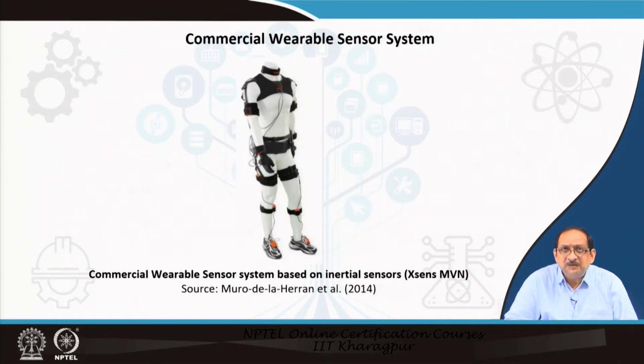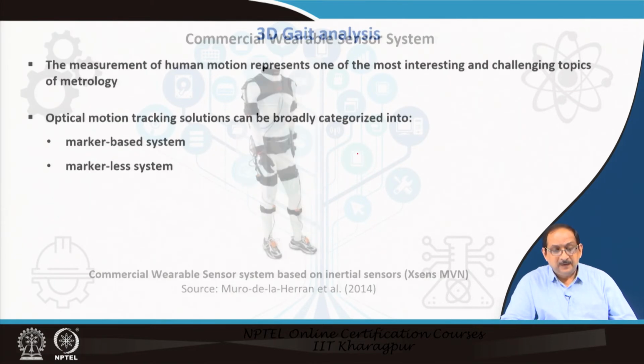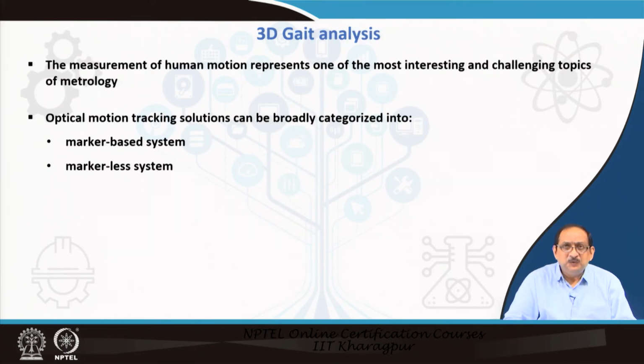A commercially available wearable sensor system is presented in this slide, as you can see, and it is based on inertial sensors. Now, let us move to the second topic in this lecture, the 3D gait analysis.